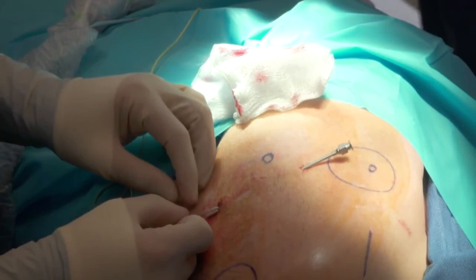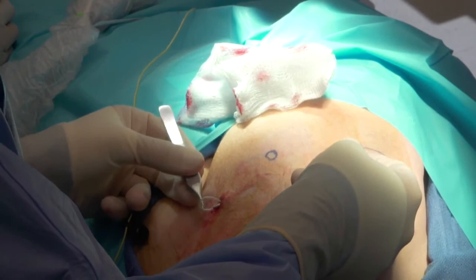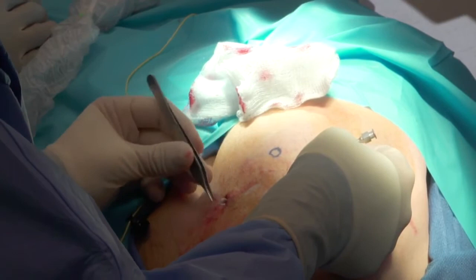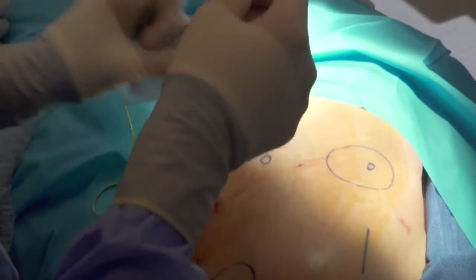Then what you're going to do is feed the electrode through, and as you're feeding the electrode through, carefully make sure not to smush the thing. And as you're coming through, then you withdraw, and you're all good. There you go. John, you're all done, buddy.